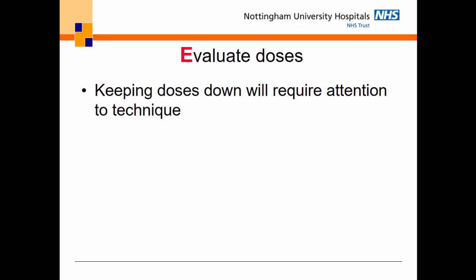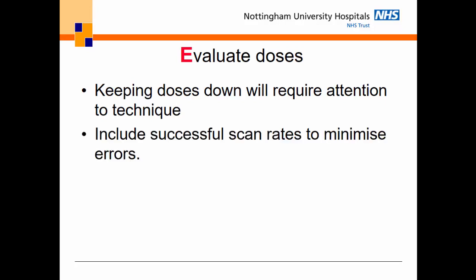You need to evaluate your doses. How many of you know what your doses from cardiac CT are? Okay, one person. If you don't, you should. If you're going to get into this, you really need to know for your centre what doses you're delivering to your patients, and you also ought to know what your success rates are. How often, using the techniques that we've got, do we get a successful high quality scan?